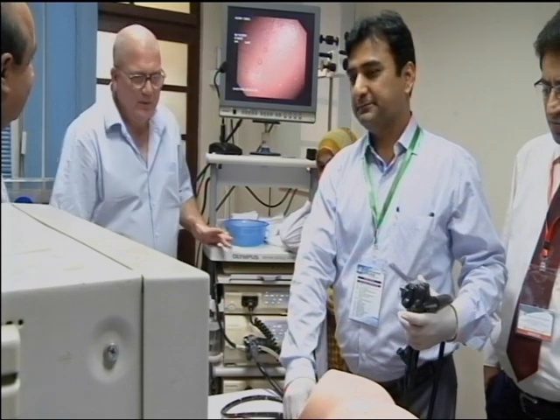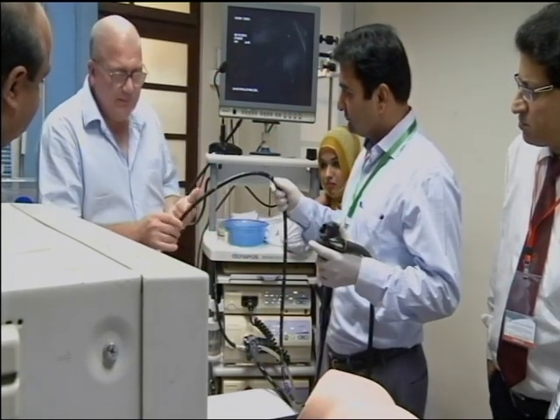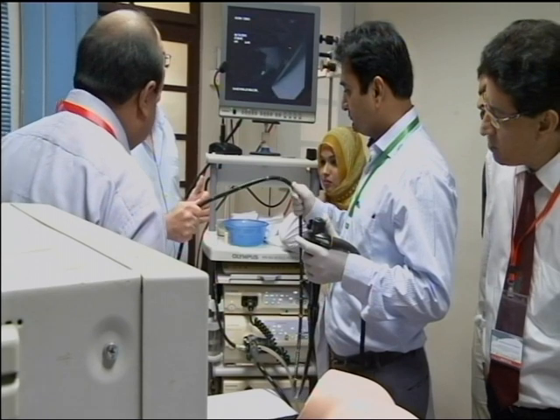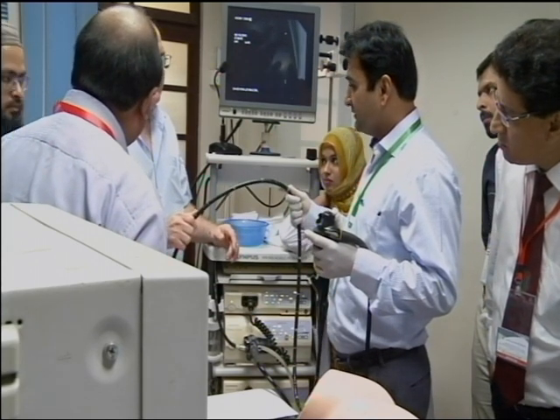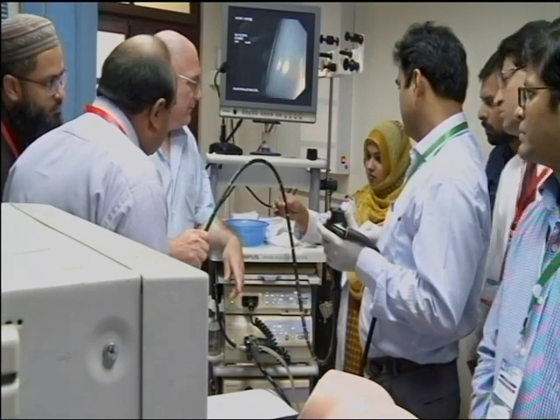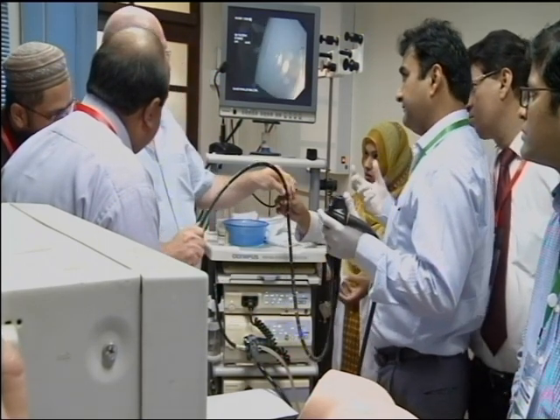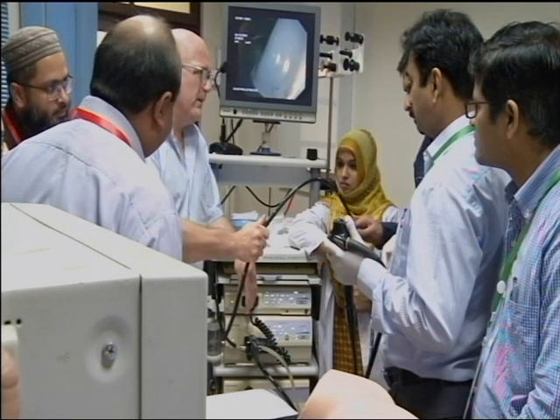Right. Freeze. Now, if we just take the scope out, just for a second. You hold the scope here. How are you holding the scope? Just hold the scope in your hand. How does that feel? Does it feel nice and relaxed? Yes. Now how does it feel? It looks hard. Hold that scope there, just feel it. It feels hard. It doesn't look relaxed. How does it feel? Without the gel in it, how do you hold it? All I'm doing is just gripping it. It's resistant. It's hard, stiff. How does that feel? If I put that in, how does that feel? That'll exaggerate it.